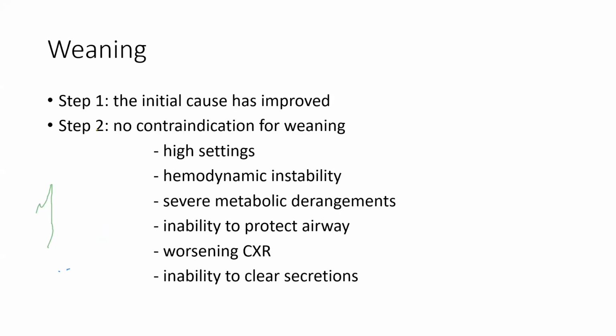After you have initiated mechanical ventilation and after you have adjusted the ventilator to the patient's specific needs, you watch. Remember that we said mechanical ventilation should always be coupled with the definitive management that is targeting the patient's pathology. As the patient improves, you should always be thinking of weaning, because we said we want to minimize the duration of mechanical ventilation as much as possible.